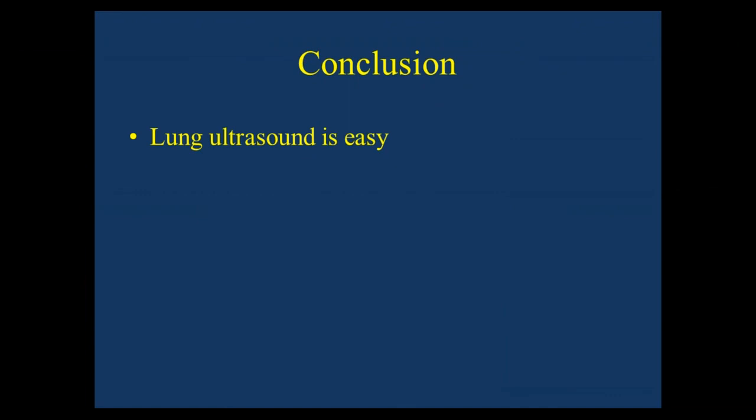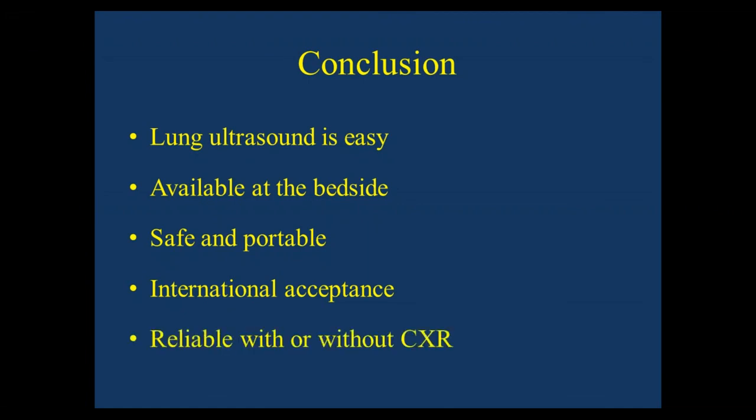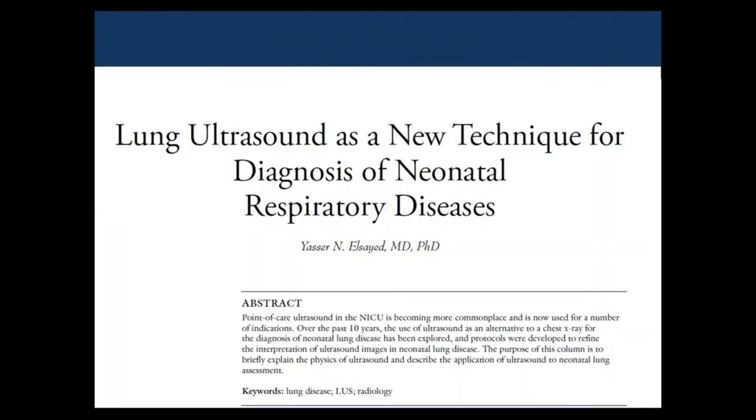Then the conclusion: lung ultrasound is easy, available at the bedside, safe and portable, with international acceptance, and some units all over the world have started to rely more on lung ultrasound for assessment, with less X-ray exposure. It is reliable with or without X-ray, so you can do it as a parallel modality to the X-ray or without X-ray.